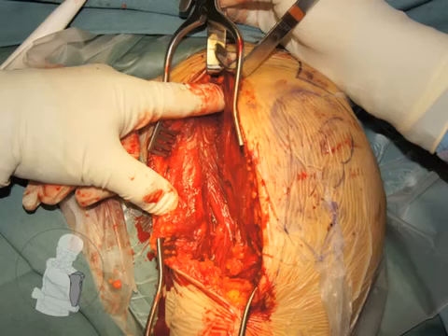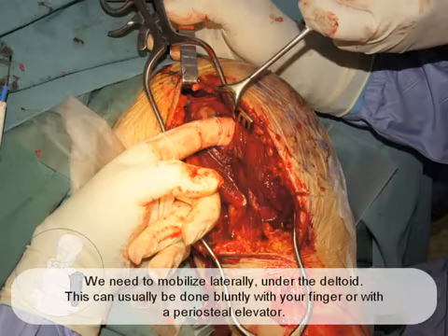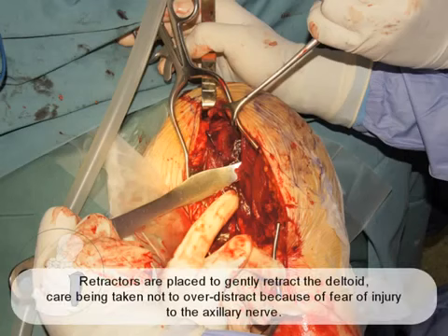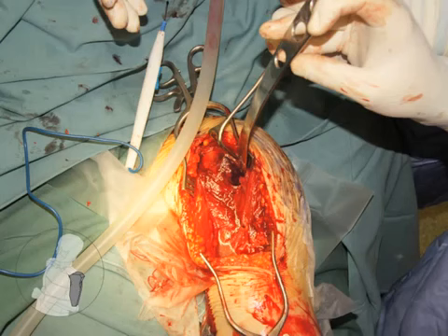It's extended proximally and distally, giving adequate visualization of our entire surgical field in preparation for our reduction and ultimate fixation of the fracture. We once again need to mobilize laterally under the deltoid. This can usually be done bluntly with your finger or with a periosteal elevator. Retractors are placed to gently retract the deltoid, care being taken not to over-distract because of fear of injury to the axillary nerve. With retractors in place, we're able to start visualizing our fracture and the fracture fragments.